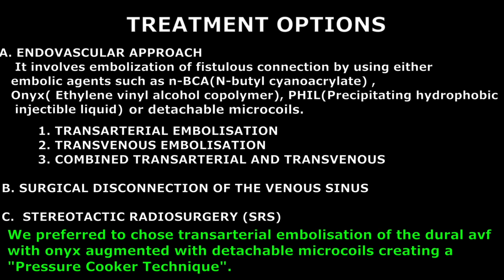C. Stereotactic radiosurgery. We prefer to choose trans-arterial embolization of the high-flow dural AV fistulas, Cognard type 2A plus B, using liquid embolic agent Onyx 34, protected with detachable microcoils creating a pressure cooker effect. The trans-arterial route was chosen as the dural AV fistula has multiple arterial feeders and it would be difficult to embolize it with the transvenous route.